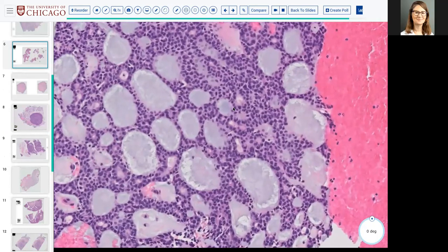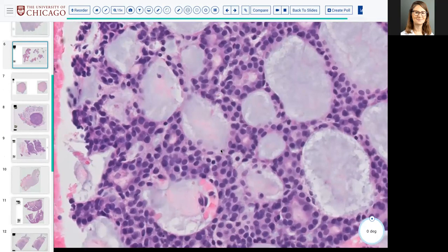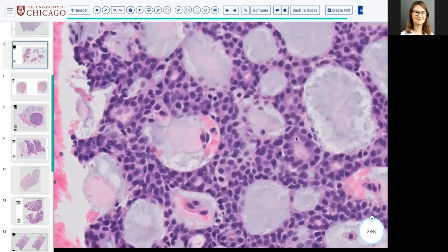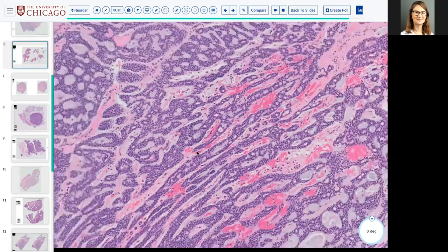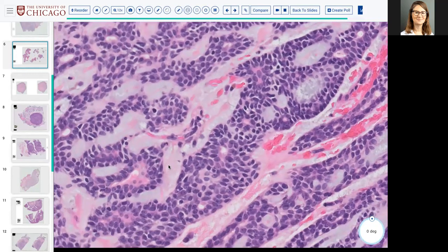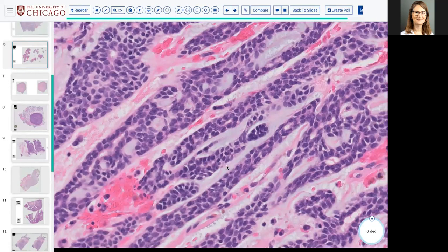Characteristically, the nuclei of adenoid cystic are smaller and darker, rather than very open, and usually don't have clear cytoplasm, even though this is myoepithelial and epithelial cells. The myoeps and adenoid cystic do not tend to have that clear cytoplasm. They tend to have somewhat scant cytoplasm and very wrinkly nuclei. And the stromal material that you see here, the bluish mucinous myxoid stroma, is secreted by the myoepithelial cells.